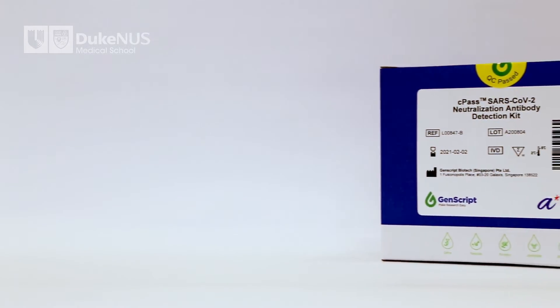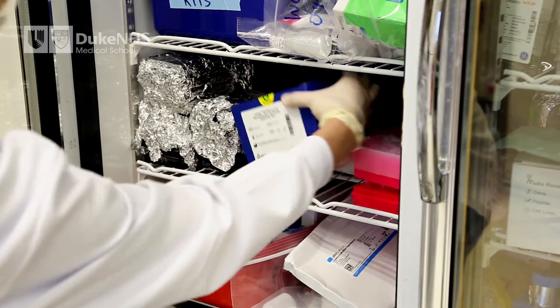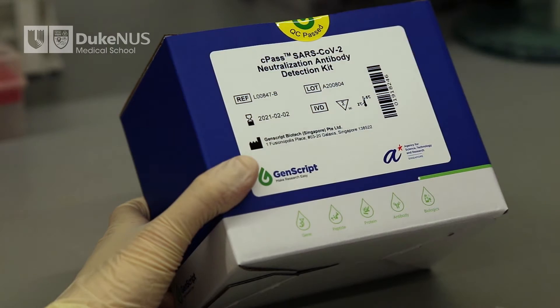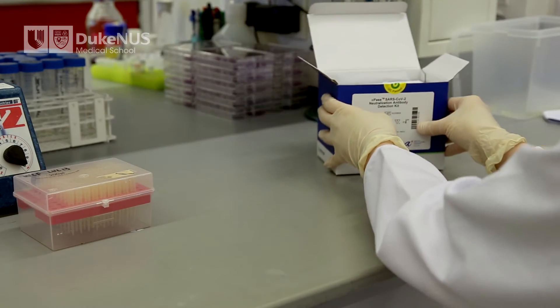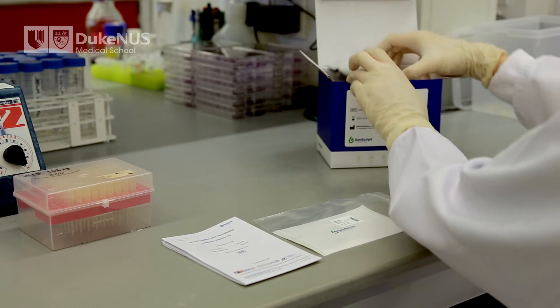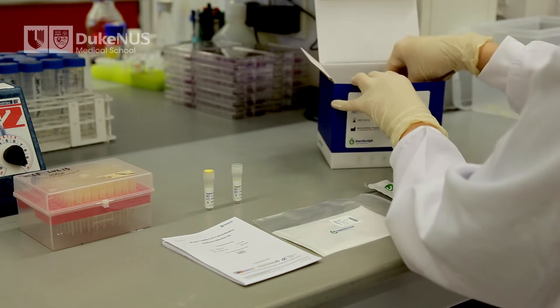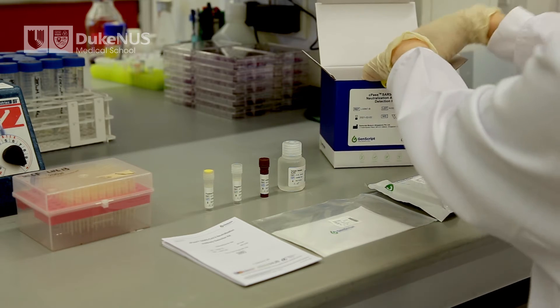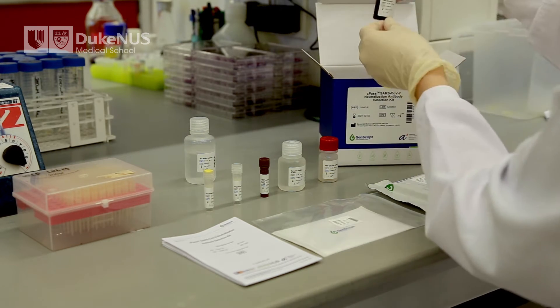The cPass kit comes in a box that should be kept between 2 to 8 degrees Celsius. Only take the box out of the refrigerator when you are ready to use it. Make sure the box is properly sealed and has no external damages, and check the expiry date. Inside the box you will find: a user manual, two pieces of plate sealer, a capture plate, a positive control tube, a negative control tube, the HRP conjugated RBD, sample dilution buffer, dilution buffer for the HRP, 20 times concentrated wash solution, the TMB solution (which should be protected from light), and stop solution.